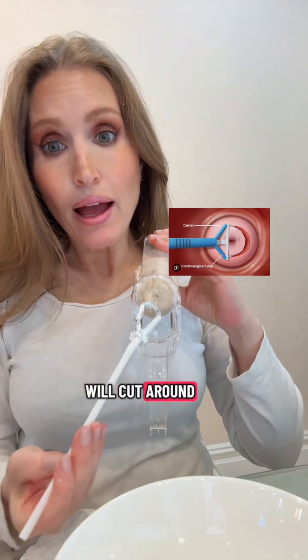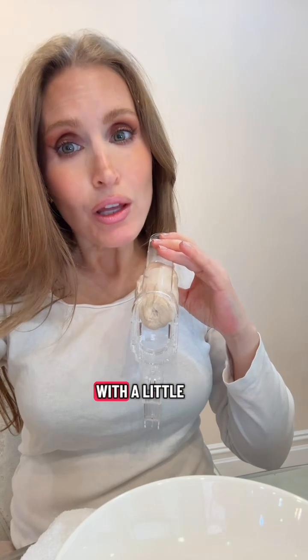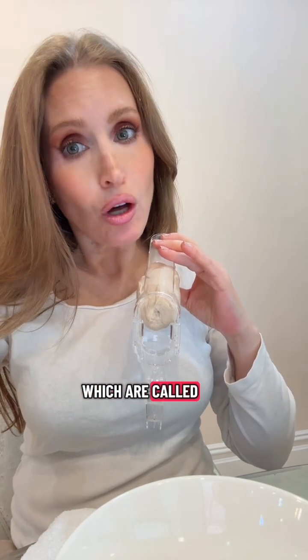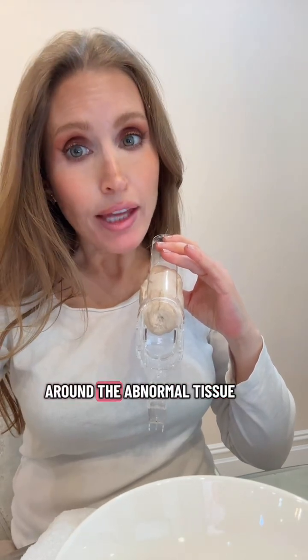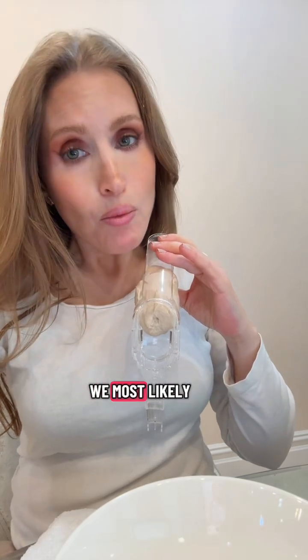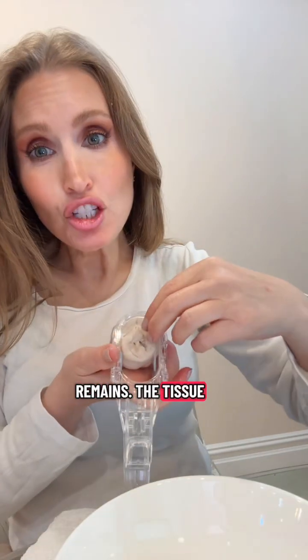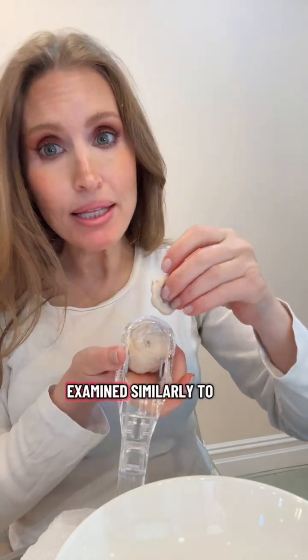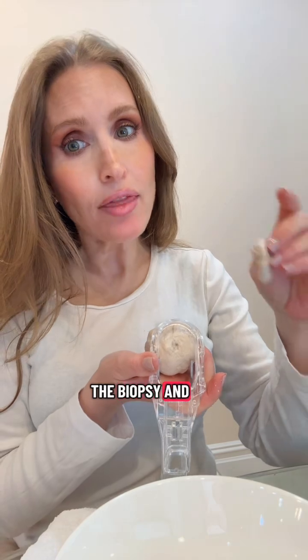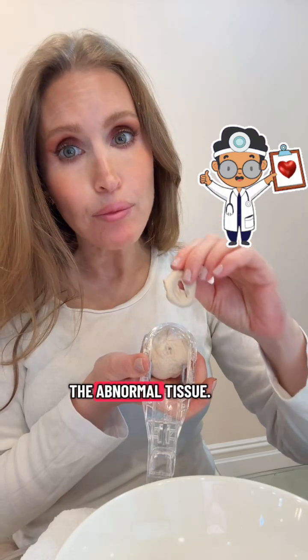We'll cut around the cervix. The goal is to remove enough of the abnormal tissue with a little bit of normal tissue, which are called clean margins that surround the abnormal areas. The clean margins around the abnormal tissue will ensure that we most likely have removed all of the abnormal tissue and that none remains. The tissue that is removed will be sent off to pathology and it'll be examined similarly to the biopsy and the Pap smear. And the pathologist will make sure that we have removed all of the abnormal tissue.